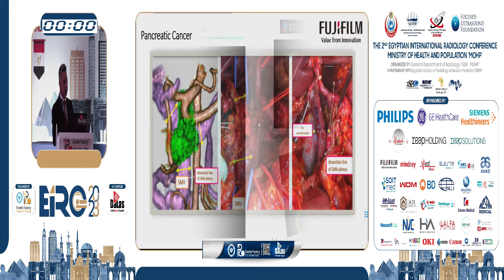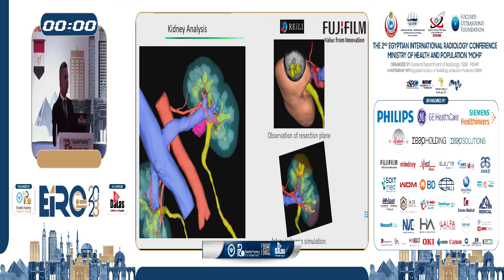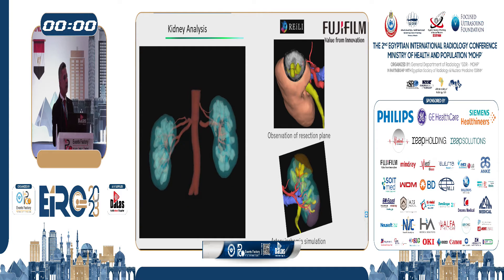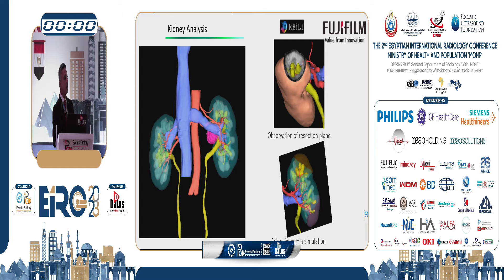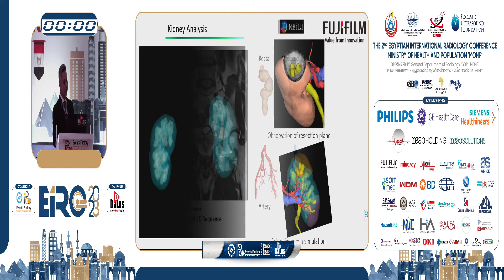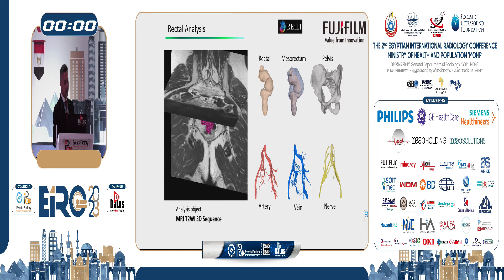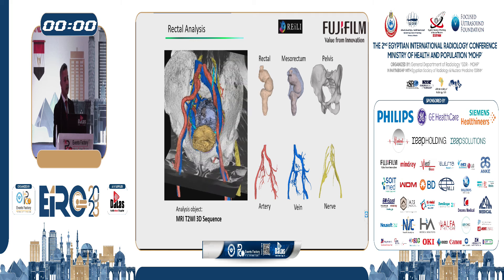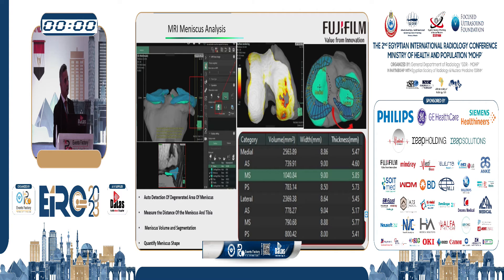For kidney analysis, Synapse 3D with one click can configure, segment, separate, and determine the contour of the kidney, specify the renal artery, renal veins, and ureter, extract the tumor, and observe resection planning. It can also detect blood flow in the renal artery for ischemic simulation. For MRI rectal analysis, it separates and extracts the rectum, mesorectum, pelvic artery, vein, and nerve. The final module covered is the degeneration of the meniscus of the knee.